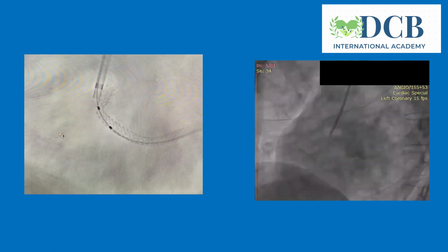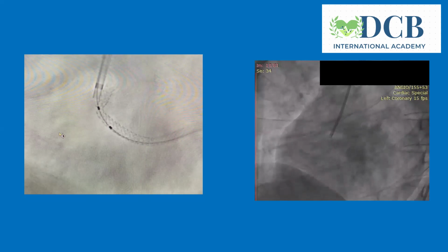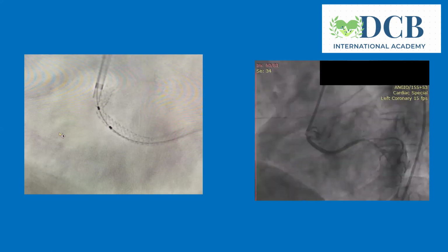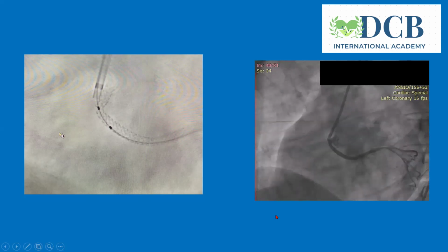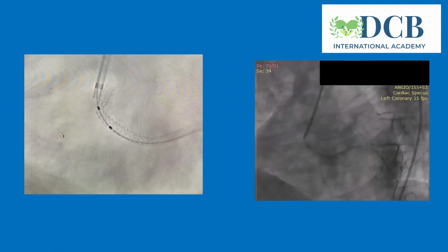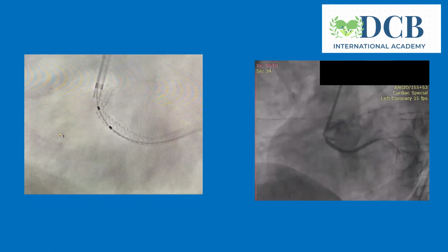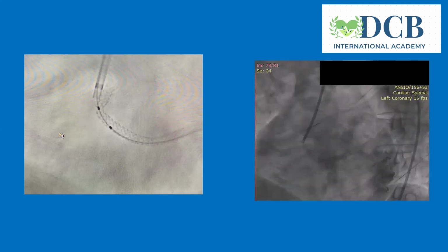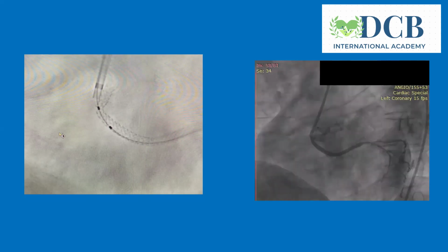Another thing is that you can just push the wire. You are here on the left. You push the wire, you get the catheter a little bit out, and then you try to rewire with another wire. The other thing I've done is something similar, and then use a Supercross angled microcatheter. So you float the guide back out with the wire in position, then use a Supercross and aim it 90 degrees, and then wire it. That's what I've done previously.